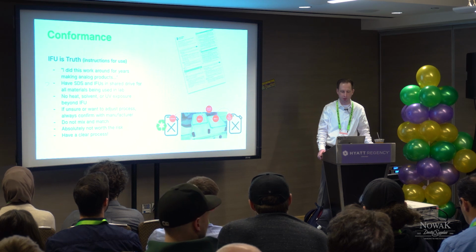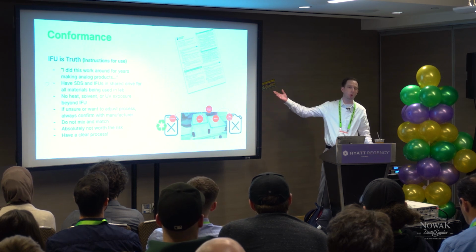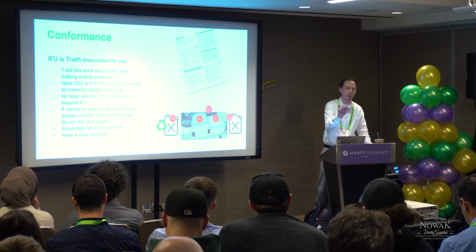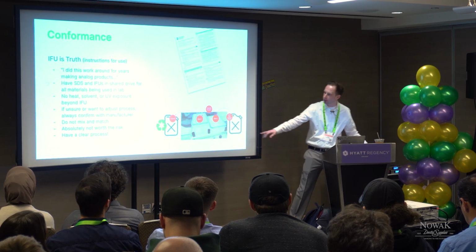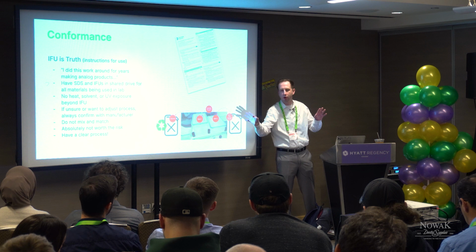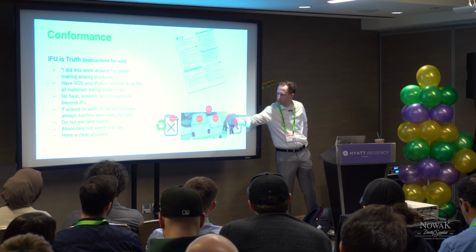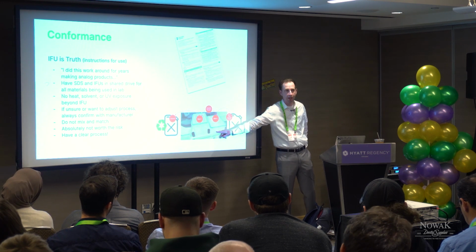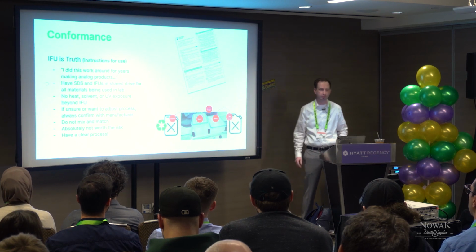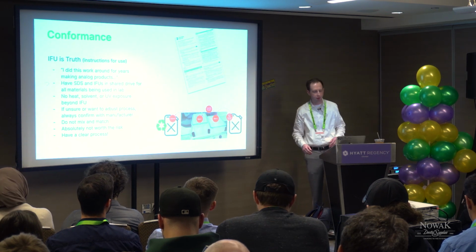It's about risk mitigation. And do not mix and match. Do not wash Lucitone denture base with Keystone soft splints. They need to be in their own solvents, period. This is actually pretty nice. There's no perfect wash solution, but these are in an orbital shaker, which is nice because then you can have buckets dedicated to the various products. So you don't have to have five different washing units.